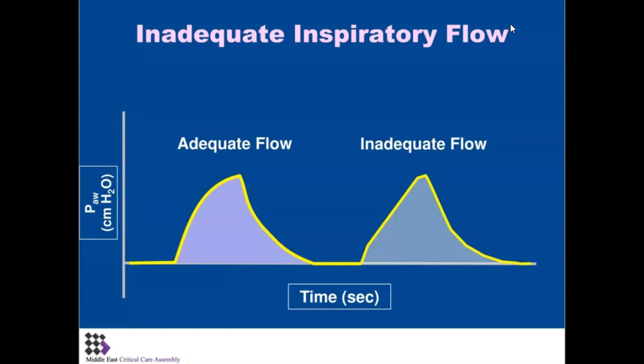Over here in the second example, you see that this side of this peak has gotten quite flat, and in severe cases, it can get a little concave where it ends up scooping in like this. In really bad cases, get my little drawer tool out again. Let's see if I can struggle again with this. So if it's worse, it looks like this, where it's really scooped out. And sometimes I've even seen it so bad as it looks like this. Change colors here.